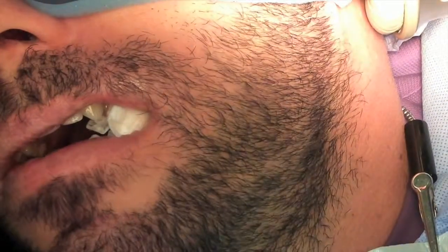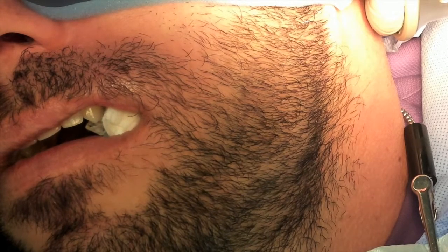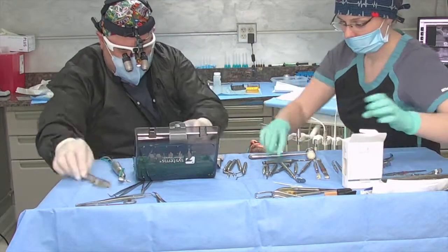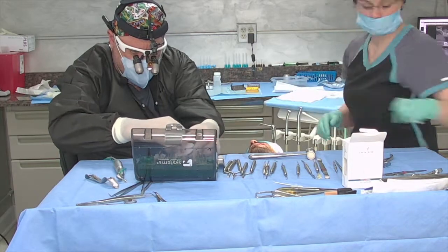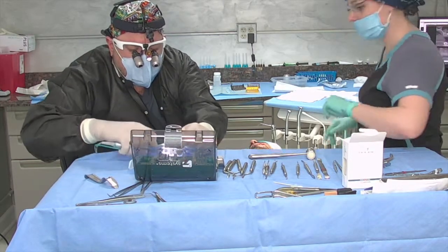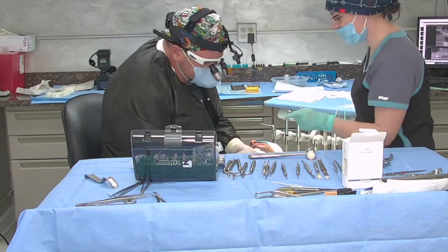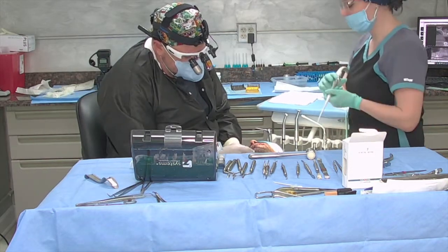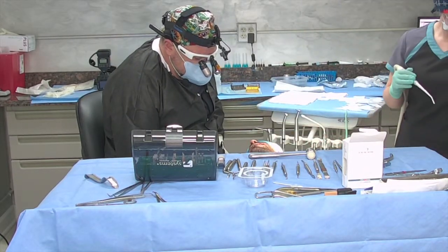Okay, Matt, we're going to go ahead and bite down again. And then, you know, we can take this away for a second. Yep. So we're going to come over. So we have a 5.0 by 10 implant. My drill's at 45, right? 45, yes. Yeah, okay, good. All right. So. Let's reverse. Okay. I'll take care of that now. Thank you for telling me that. So there's our 5 by 10 millimeter Z Systems two-piece implant, okay?